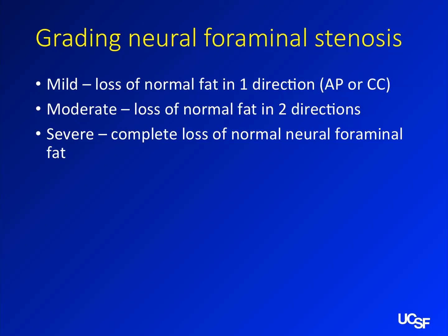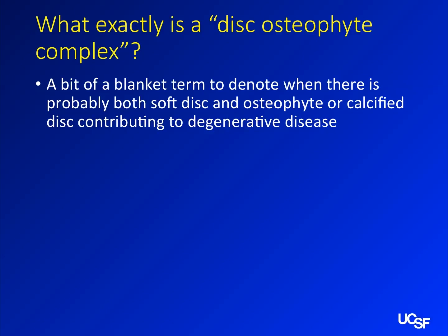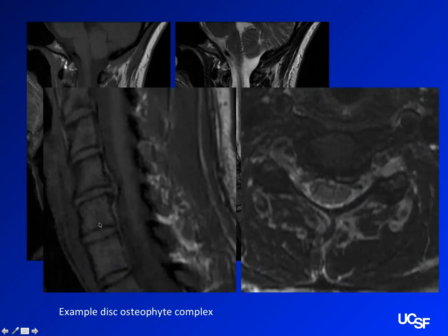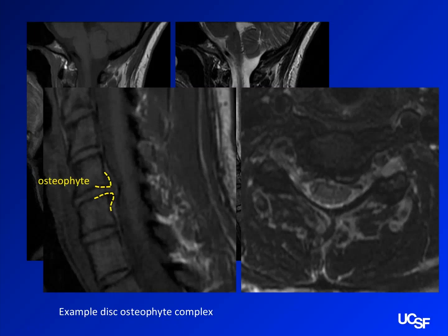Disc osteophyte complex — what the heck is that? People use that term, some more than others. It refers to a combination of a disc and a calcified osteophyte. Here's an example with degenerative disease in the cervical spine — you've got a disc coming out, and if you zoom in, you can see there's actually new bone forming around it. Discs tend to be smooth, but once you get bone formation there, you get this lumpy bumpy appearance. That's when I'd use the term disc osteophyte complex.